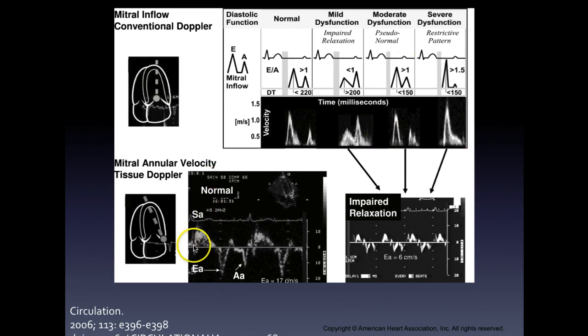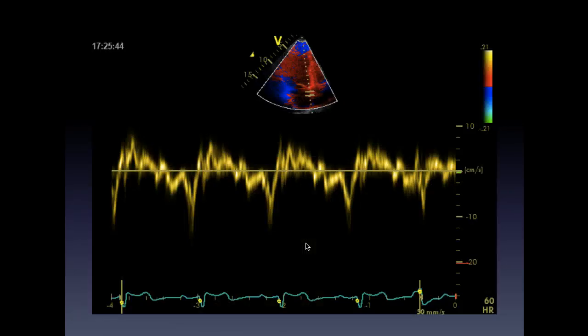What we do is we have the tissue Doppler area of interest placed on either the lateral or the medial annulus. And we're looking at the excursion of the mitral annulus in systole. And there are normative values produced for systolic excursion. It's useful numbers. On average, healthy young people will have velocities of maybe 12 centimeters per second. Once you start getting below 10, you begin to question dysfunction. And if it's, say, 4, 5, or 6, you can pretty reliably say that systolic function is reduced. It isn't useful in every case, but I will show you an example later where it did prove useful.